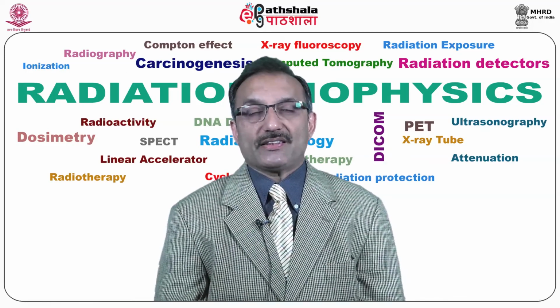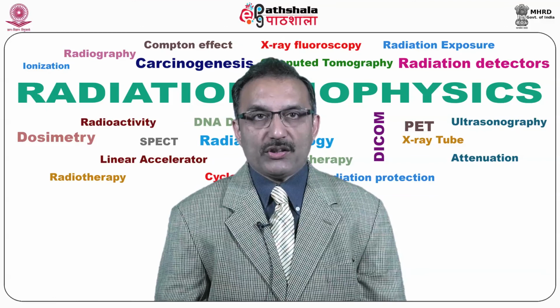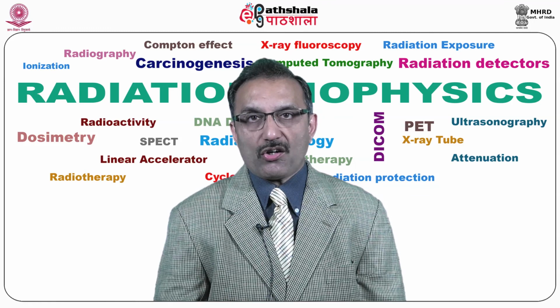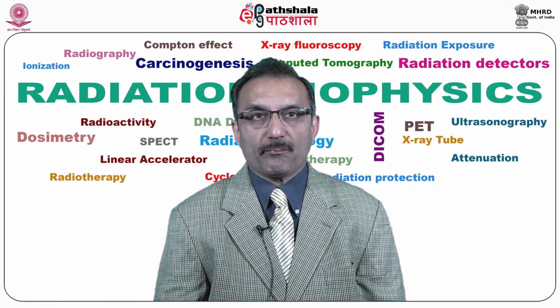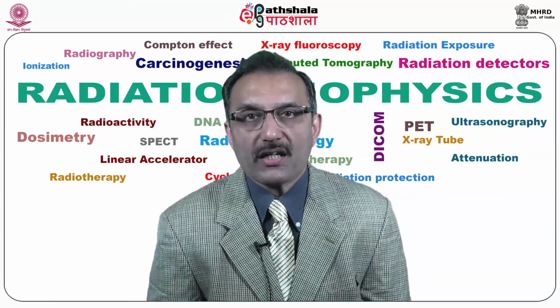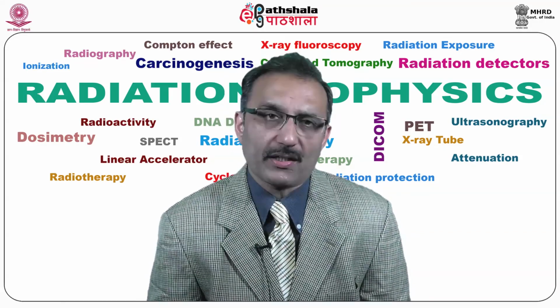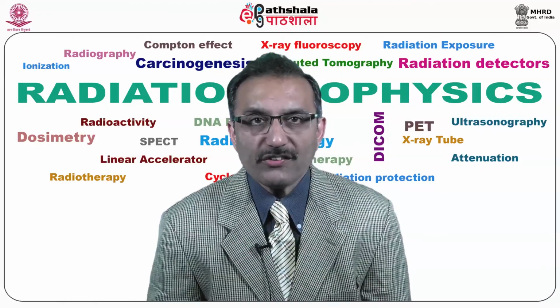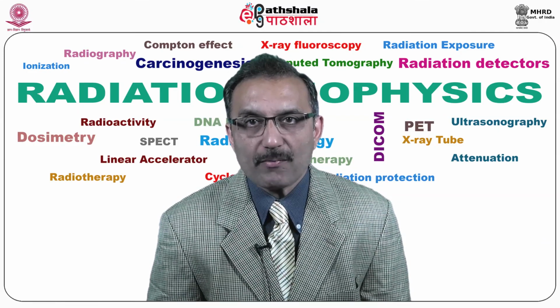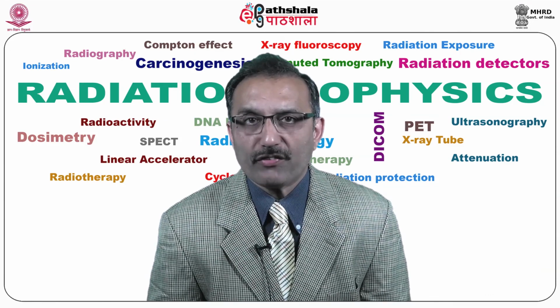What are the benefits versus risks? Definitely any modality we talk about has certain benefits and certain risks. Because PET allows study of body function, it can help physicians to detect alterations in biochemical processes that suggest disease before changes in anatomy are apparent with other imaging tests such as CT or MRI. These are the benefits. Because the radioactivity is very short lived, your radiation exposure is low, and the substance amount is so small that it does not affect the normal function of the body.